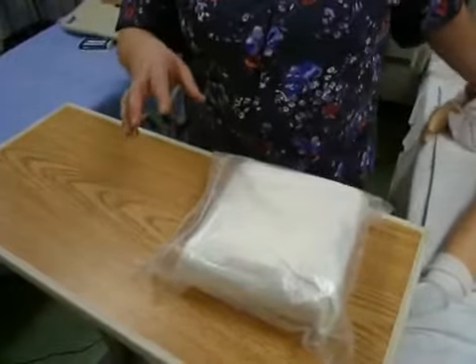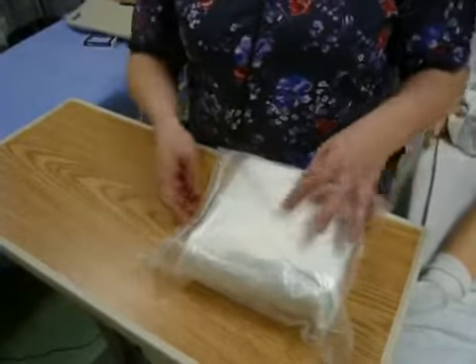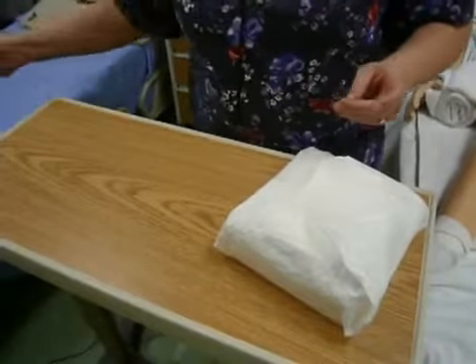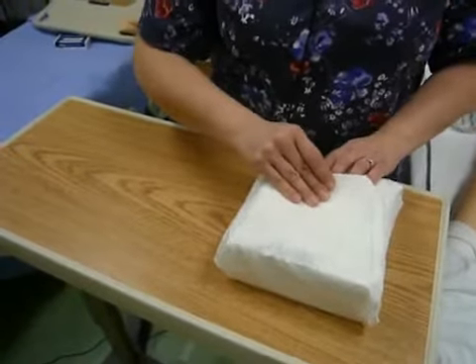Now, because I'm setting up my sterile field on the bedside table in front of me, I'm going to put the towel, washcloth, and gloves on the bed so that they're where I want them to be when we're done. I'm going to take out my catheter kit from the packaging. I'm going to throw away the outside packaging. I also have a garbage can at my foot, so you may see me drop some things off the end of the field, and that's where they're going.